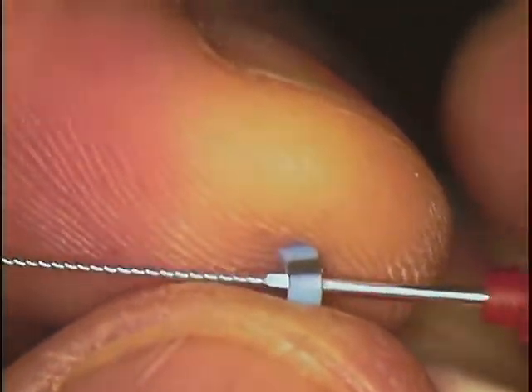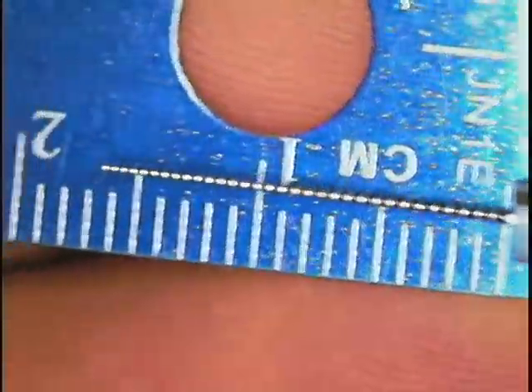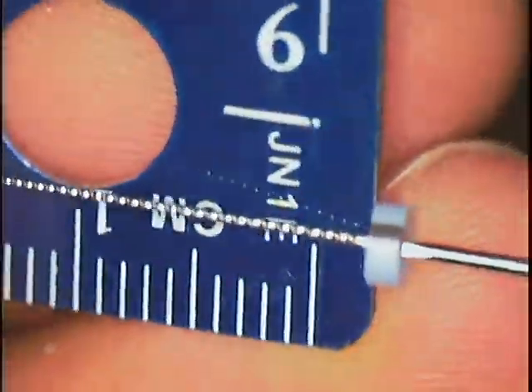Okay. I'm going up to a number 25, so that's red. And normally under red, whenever you get to a red file in the mouth, you want to think flaring. We want to flare. We don't want to create this Washington Monument. I want it to be a funnel shape.